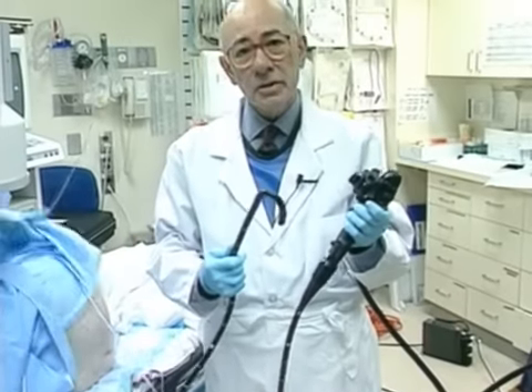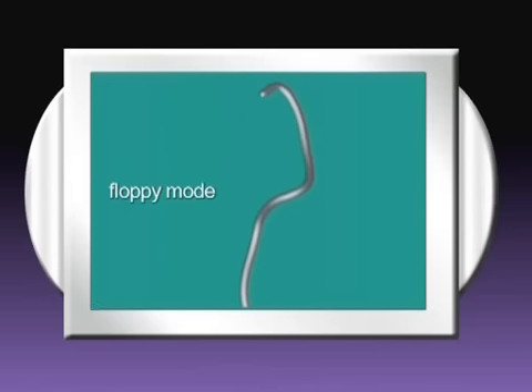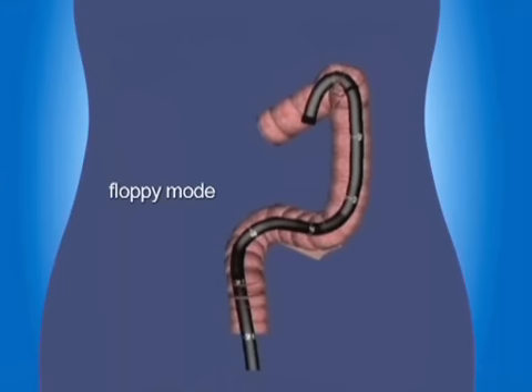It makes this instrument a pleasure to use in even the most difficult colon. This ScopeGuide 3D imager view shows how, even after straightening, a colonoscope tends to re-loop in the sigmoid and make passage around the splenic flexure difficult.